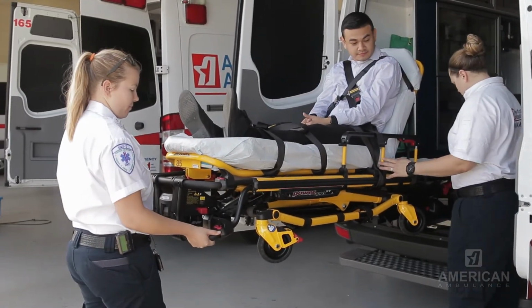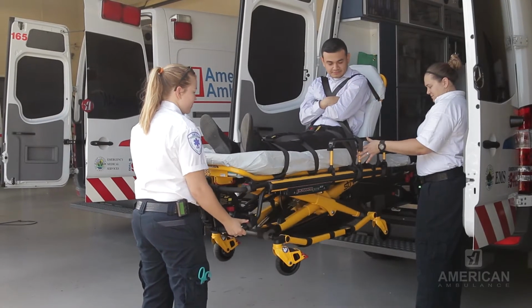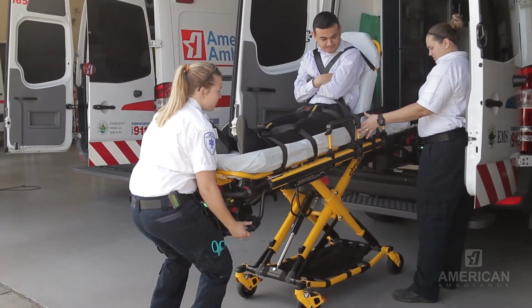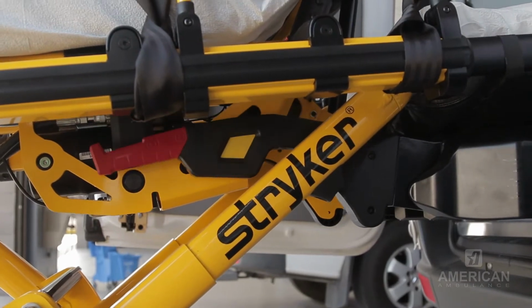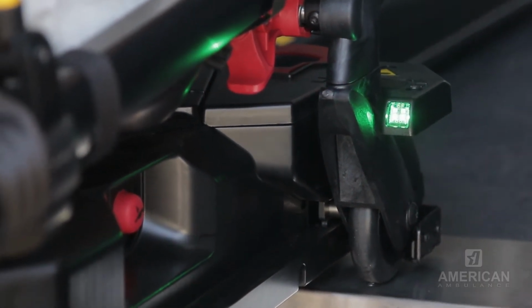Once the gurney is fully extended all the way out, you're going to simply press the plus button and the legs will begin to lower. As the legs touch down on the ground, the loading arms will also detach automatically and allow the gurney to be released. A yellow light will appear. When it turns green, you can unlock the gurney.